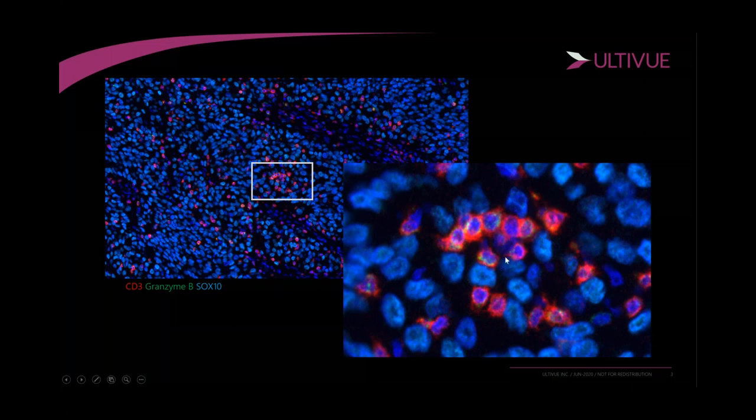And that's what we're seeing here when we look in the zoomed in section. Let's look at these two cells. So you see that this top cell is tagged by CD3, so we know it's indeed a T cell. You see that there's granzyme B populations, so you know that it's cytotoxic, but you also notice that it's polarizing to the bottom side of the cell, and that membrane is actually flattening.